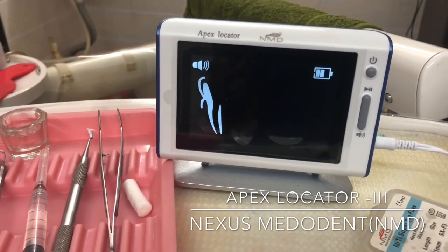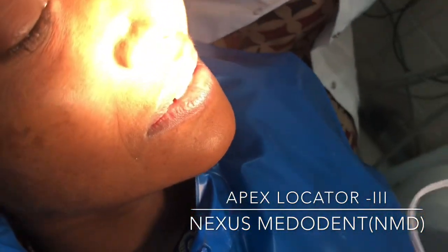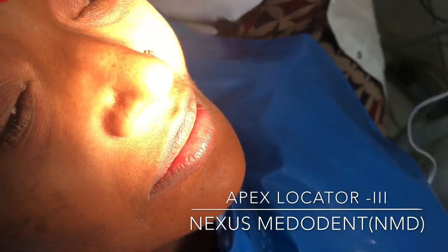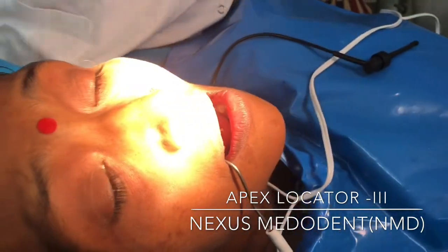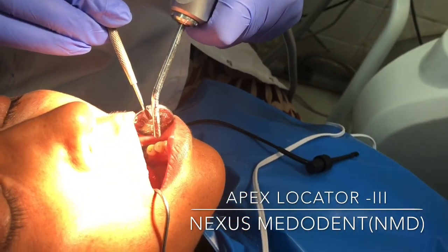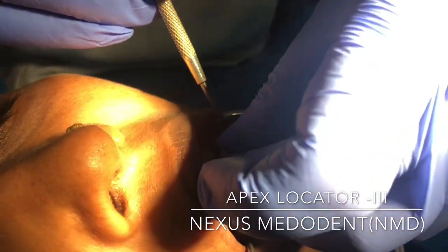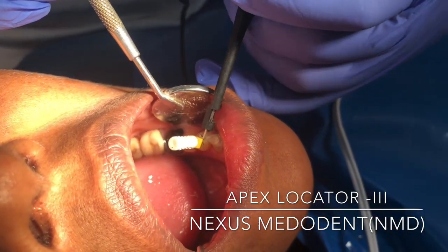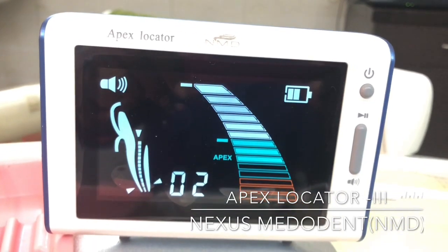So let me do this directly on the patient. I'm just placing the number 15 file, and you can see on the screen that it is still at the apex.